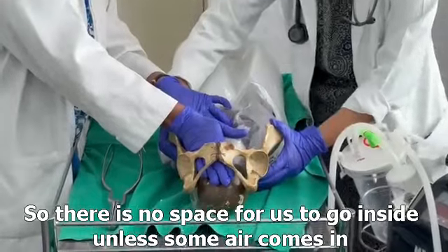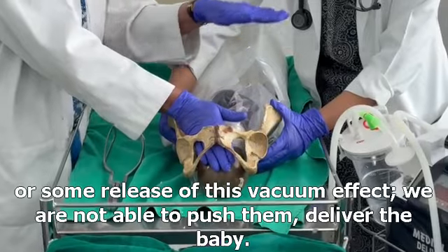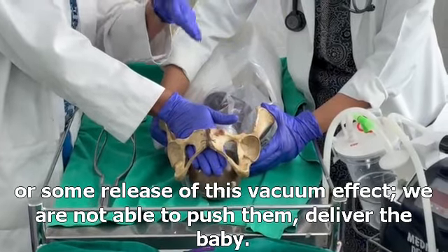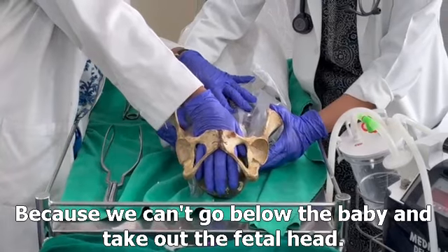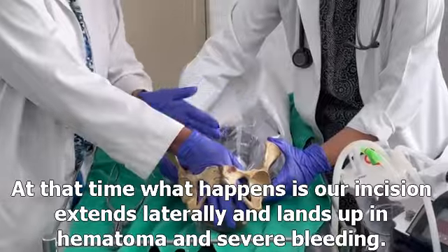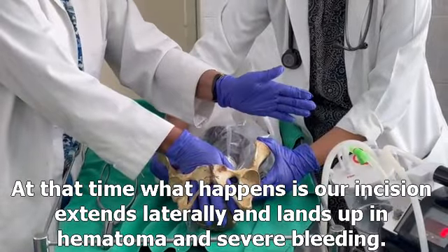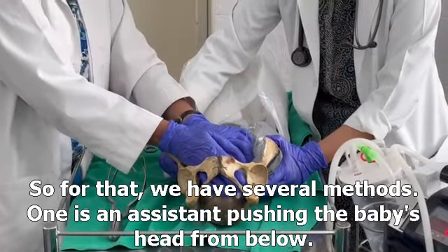So there is no space for us to go inside unless some air comes in or there is some release of this vacuum effect. We are not able to deliver the baby because we can't go below the baby and take out the fetal head. At that time, our incision extends laterally and lands up in hematoma and severe bleeding. So for that, we have different methods.